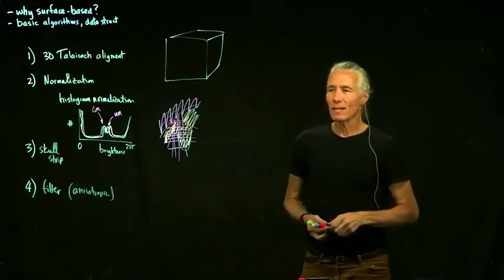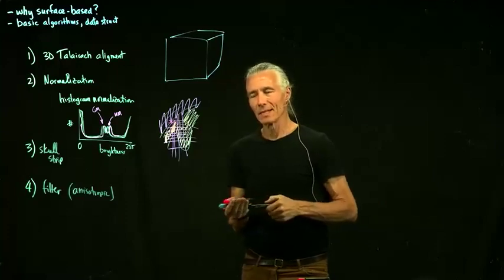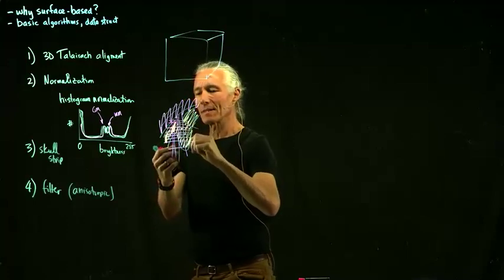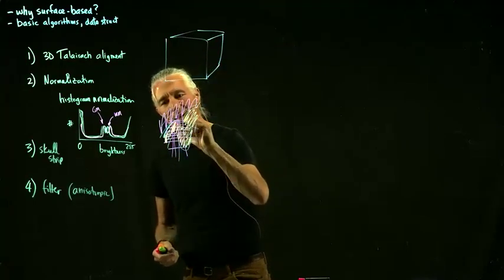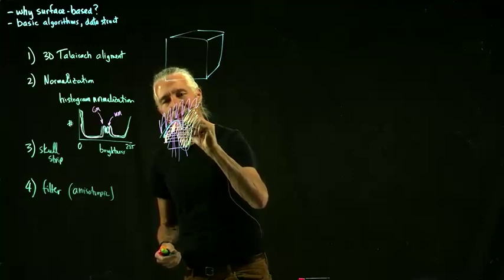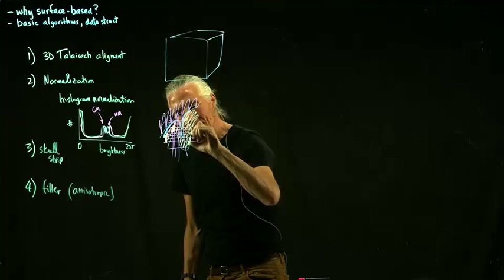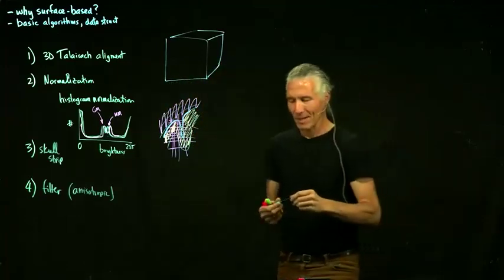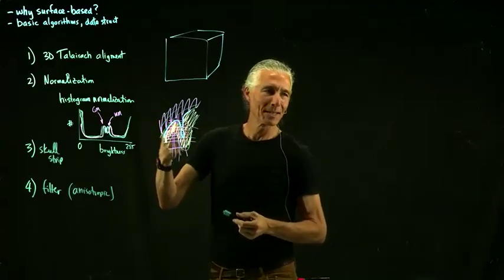But if you're trying to classify that as white matter, say you're trying to make a surface, your surface will come along like this, and then it will hit that light voxel and go like that. Then you'll have another little piece of the sulcus attached underneath it. So you'll have the heartbreak of a little wormhole between the sulcus.